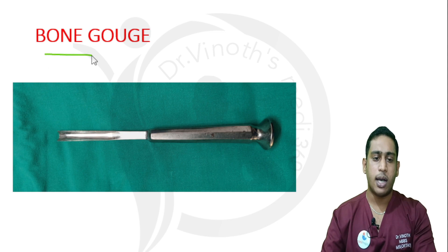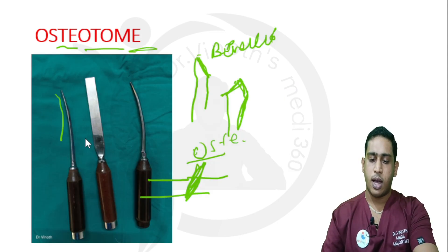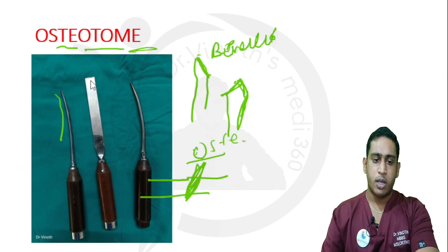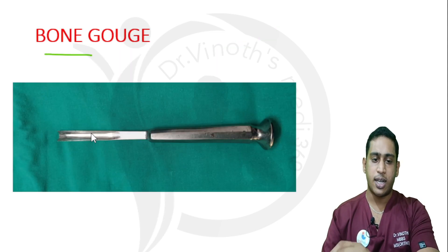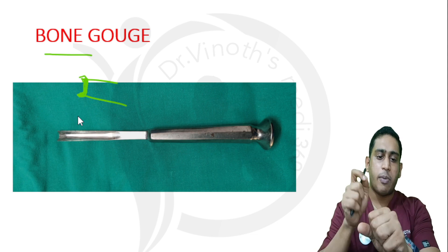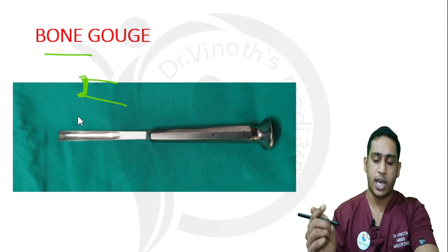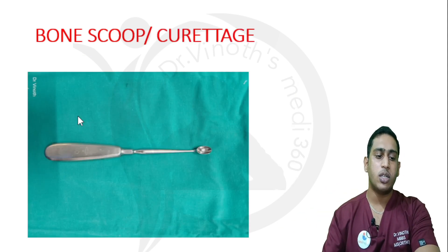This one is called a bone gouge. The difference between a bone gouge and an osteotome is that the osteotome is a solid structure, whereas the bone gouge is curved and has a hollow in the center. In that hollow shape, it is used for cutting through or chipping bone.